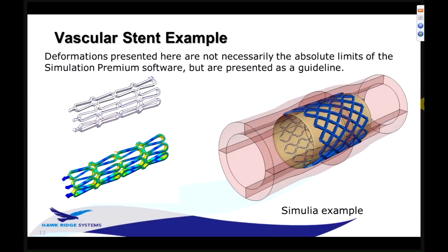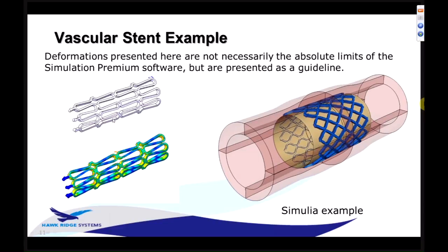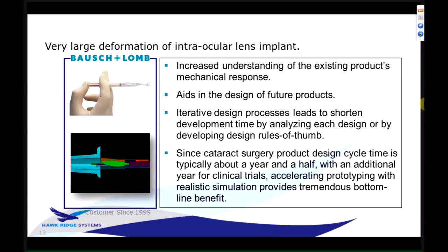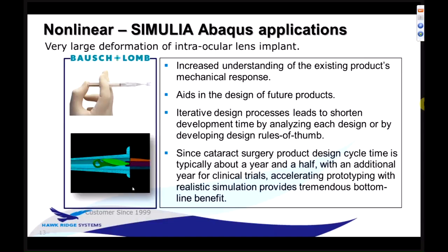And then we're still talking about SIMULIA Abaqus here. There is an example from Bausch & Lomb. They make intraocular lenses, so basically implantable lenses for cataract surgery. They go into a patient's eye, and what they need to do is fold this lens into a syringe and almost inject it into a patient's eye, and then have it fold out to the required shape. You can see some very complex, very large distortion material behavior at the bottom here. Let's see if I can make that play again. And contact between the object and the syringe wall, so we've got the ability here to really look at extreme distortions and extreme deformation when you take that next step to a tool like SIMULIA Abaqus.